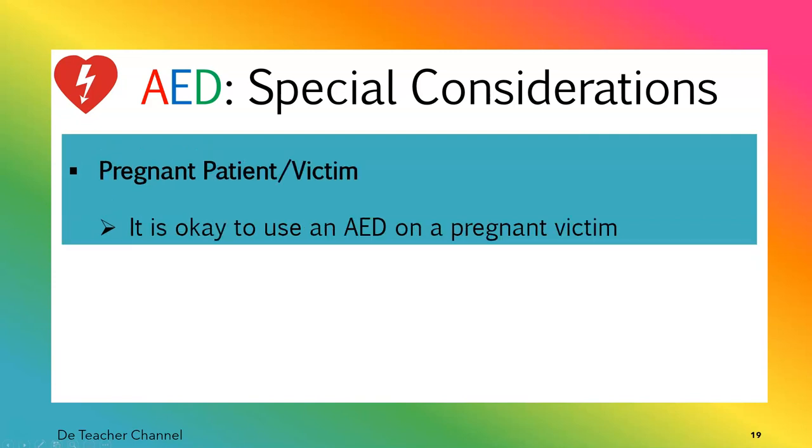Okay. So the victim could be pregnant. Sometimes people think you cannot use an AED on a pregnant woman. That is not true. It is okay to use an AED on a pregnant woman. It doesn't harm the baby. It doesn't harm the mother either. Of course, the mother is already in cardiac arrest, so we need to get the mother up. So go ahead and use it.